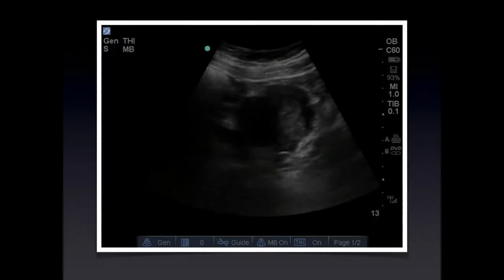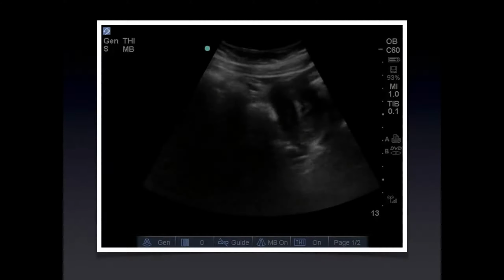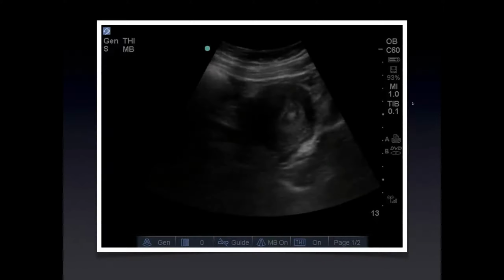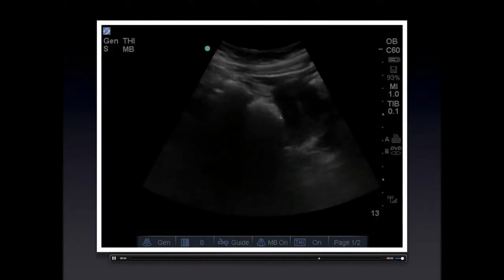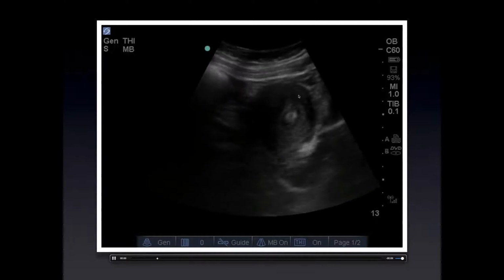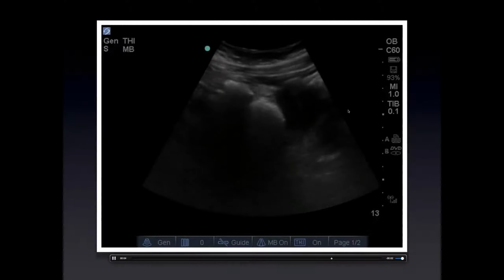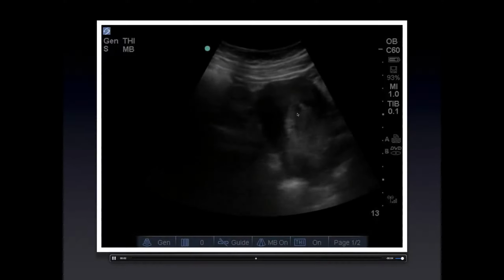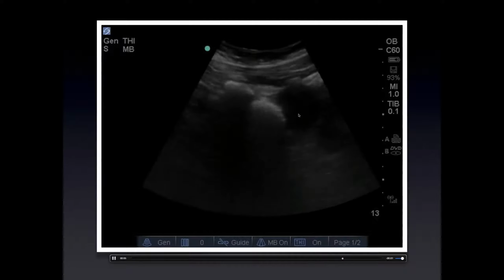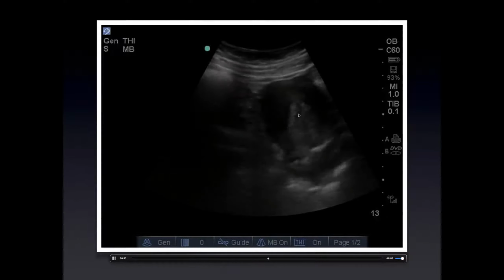Case 5. We're back to transabdominal ultrasound. You've already guessed it, we're starting in sagittal plane. Here's the fundus. Here's the cervix, vaginal stripe, bladder. Looking inside the uterus first, we see a double decidual sign and we see a small sac. However, there's no yolk sac within it, so we are not going to call this a definitive intrauterine pregnancy at this point.